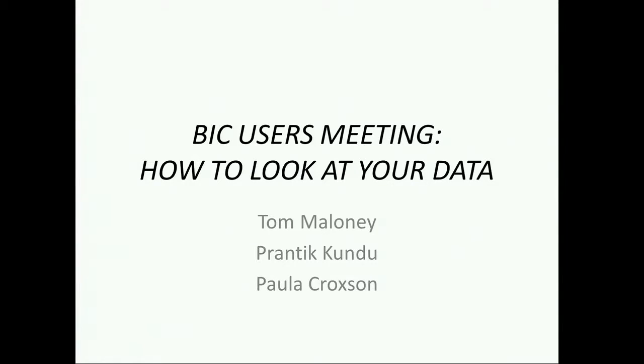This will cover a basic introduction of basically how to, in layman's terms, look at your data. It's the first step in neuroimaging data analysis, obviously. It sounds kind of silly to talk about this, but most people in reality don't look at their data until they've acquired a large amount of it, which puts a lot of people in a bad space in terms of acquiring a large amount of data and then not knowing what to do with it months or years down the line.